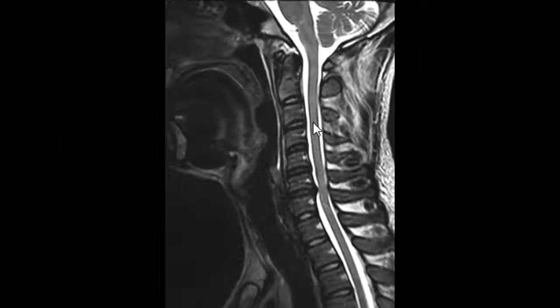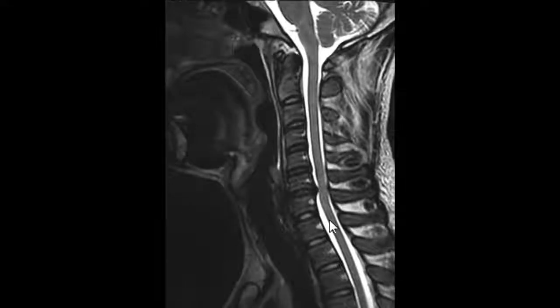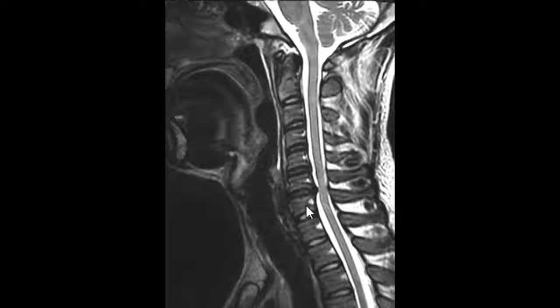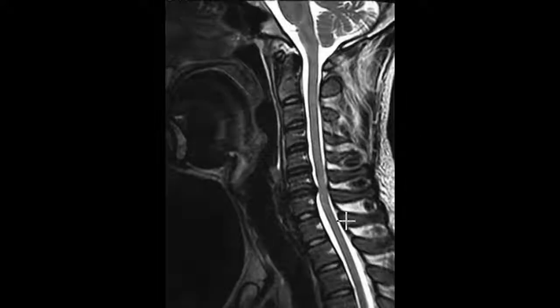The cord that comes down through the neck is surrounded by white fluid, and the cord looks pretty good. The only thing you have is one abnormal disc at this one disc level. This is between C6 and C7, and this little horizontal band is the disc that's a shock absorber.